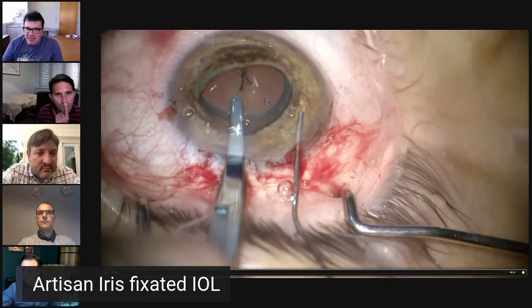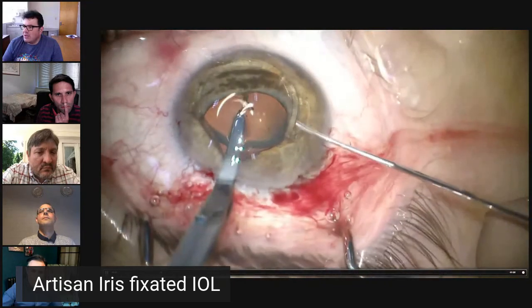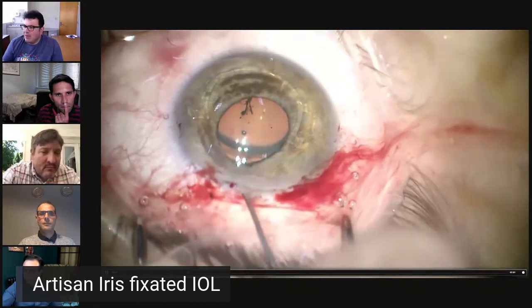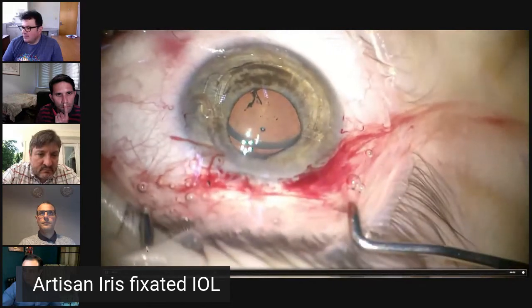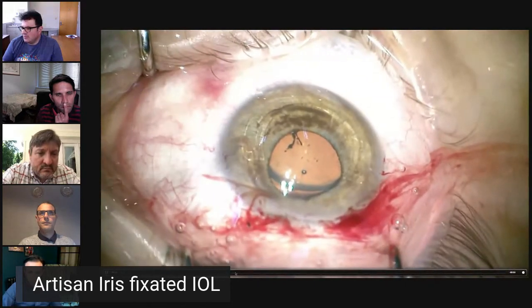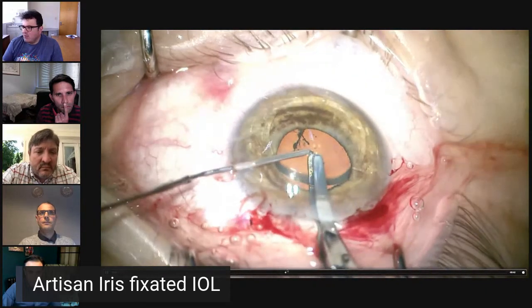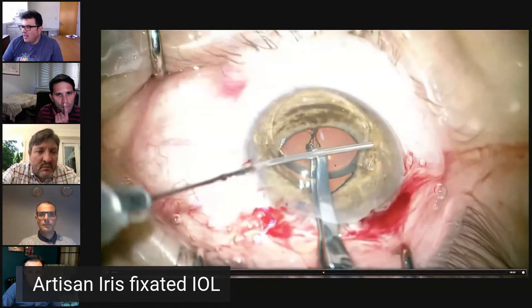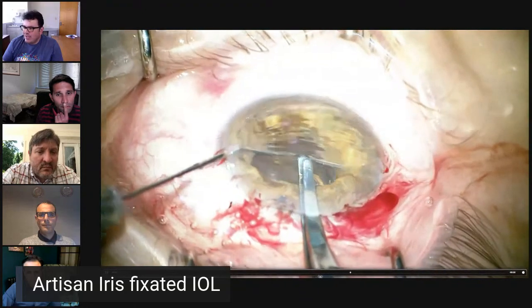I was thinking, easy, I'll do it the same way I put them in. So I hold the center and try to disengage the iris. I'm trying here again, but the problem is the lens is tilting and I'm really not able to get it out. So more viscoelastic. And I thought, okay, let's try from the other side, maybe the other side would be easier. I'm trying here, crossing over, and not going so well at all.